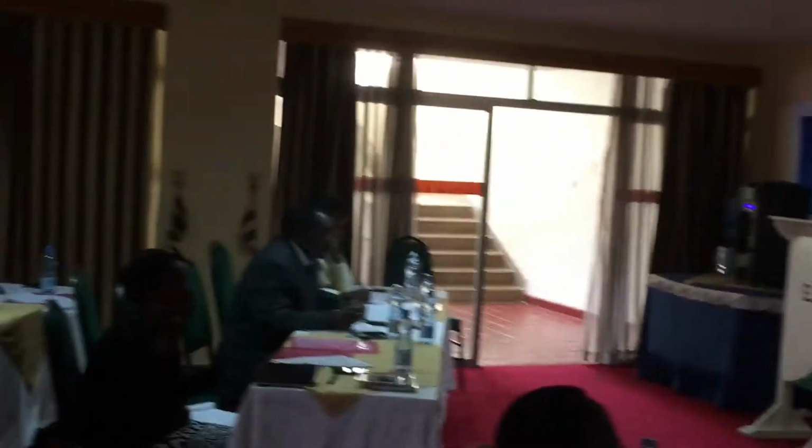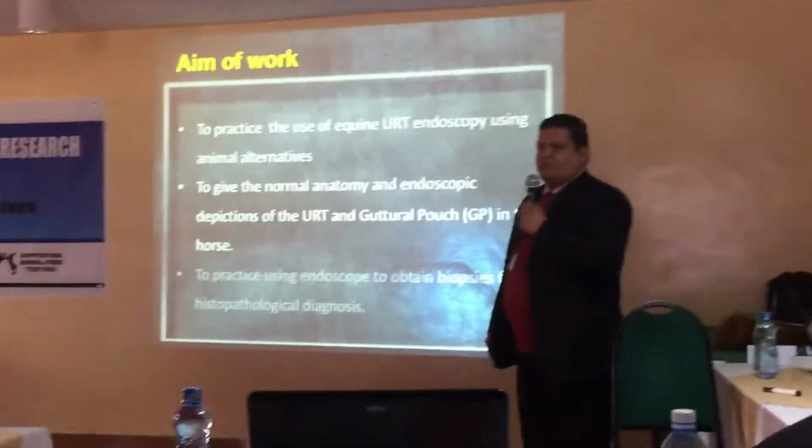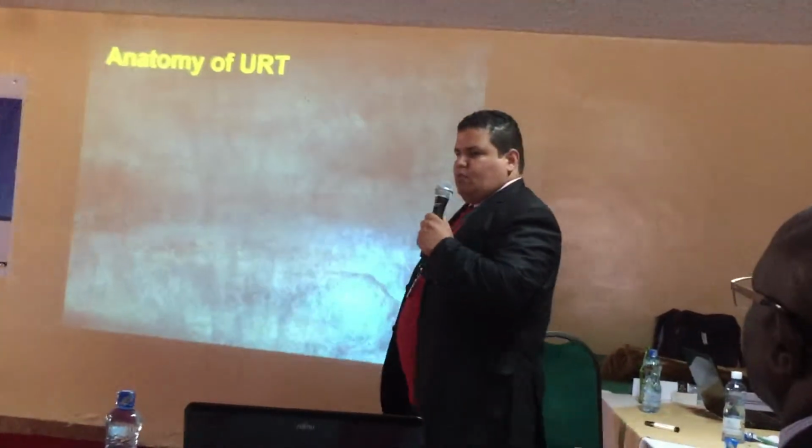Aim of work: to practice the use of upper respiratory tract endoscopy, with animal alternatives, to give the normal anatomy and endoscopic depictions of the upper respiratory tract and guttural pouch in the horse, and to practice using endoscopy to obtain a biopsy for histopathological diagnosis.